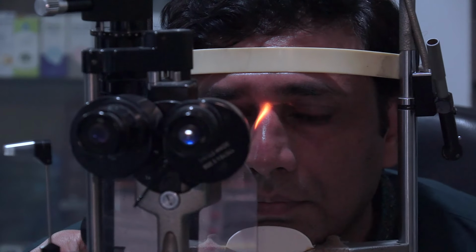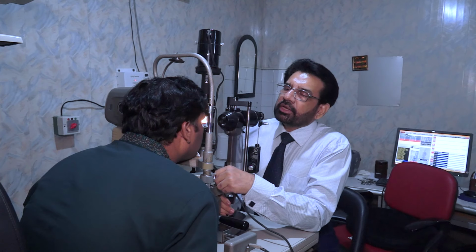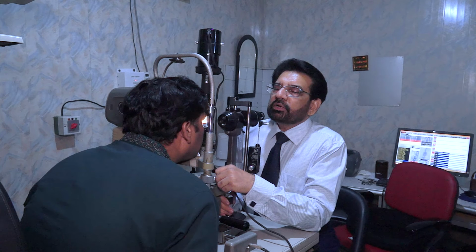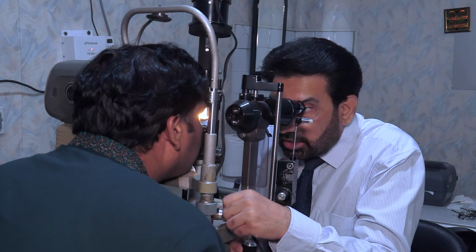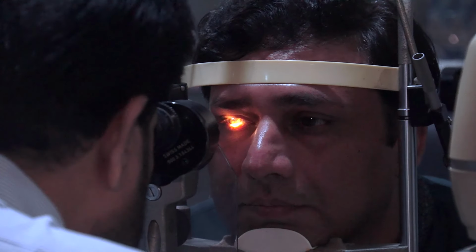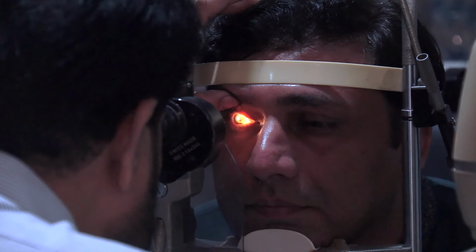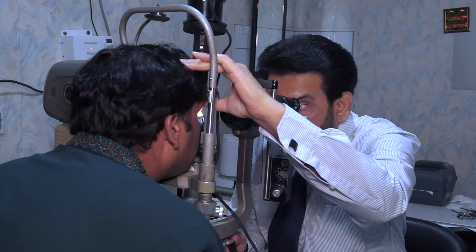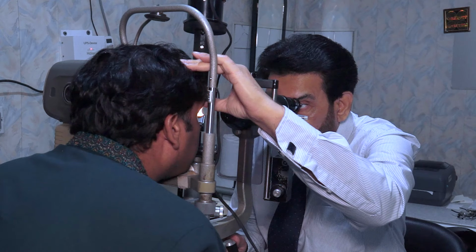Now, first of all, there is a diffuse illumination in which the whole width and length of the light is open against the eye, and then we examine with this the lids and the eyelashes and the skin of the lid, and also the conjunctiva, both the palpebral, fornical and bulbar conjunctiva, and also we can see a gross abnormality of the cornea and the iris and the pupil with the diffuse illumination.